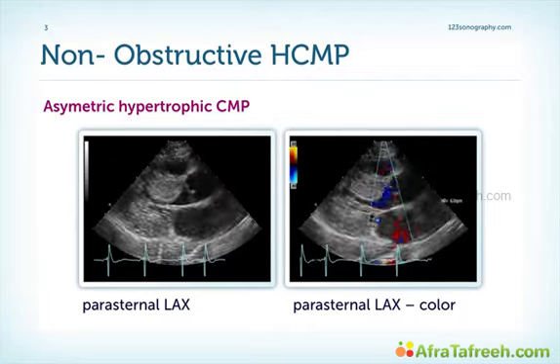We will now proceed step by step and look at the different forms. We'll see what obstruction really is. We'll see how we can quantify obstruction, which importance it has. We will then take a look at other features in the echocardiogram and also on other pathologies which might mimic hypertrophic cardiomyopathy. And finally, we'll also discuss which therapeutic option we have and what role echo plays.